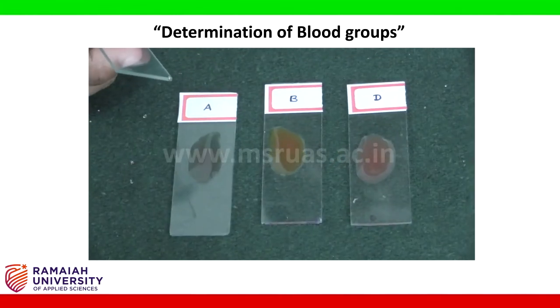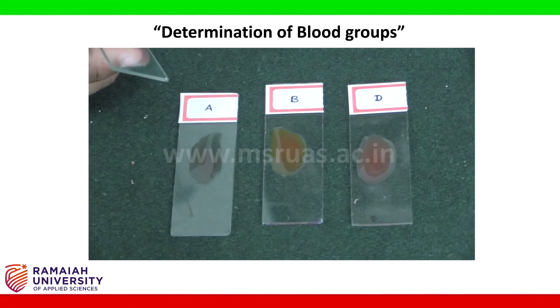And after thoroughly mixing, the slides are observed for antigen antibody reaction, which will lead to agglutination.